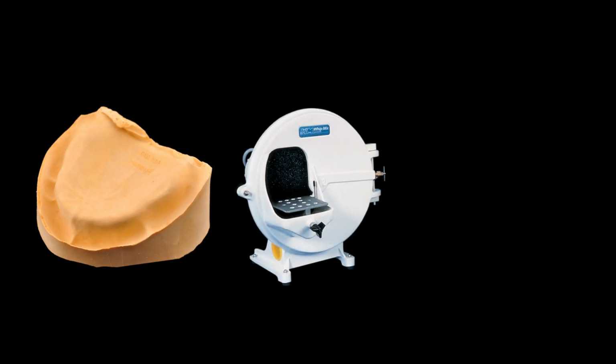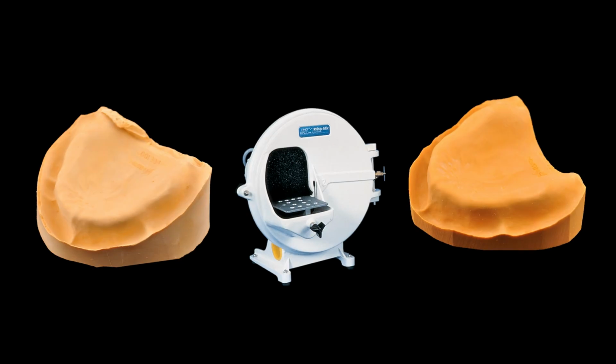Once you have removed the tray, this is what it will look like. Rough edges, potentially an angled base, and even some sharp edges. You'll take the diagnostic cast to the model trimmer to make sure you still have around 8 to 10 millimeters in thickness of your cast, especially in the posterior portion, maybe not so much on the interior, and that's okay. And that you have corrected the anterior, posterior, and lateral angles of the diagnostic cast. So this is what it should look like.